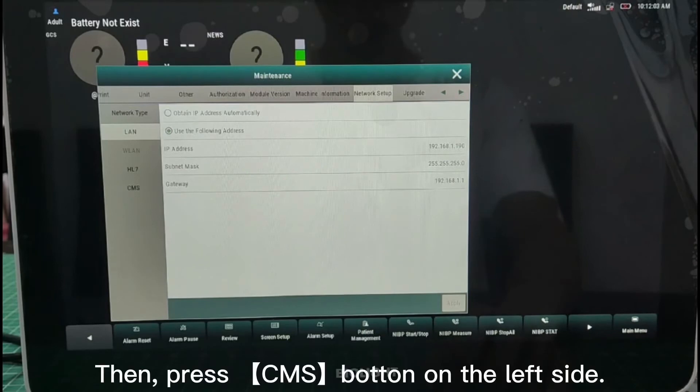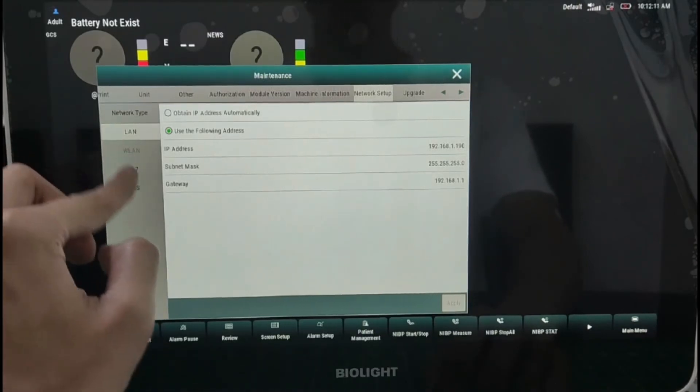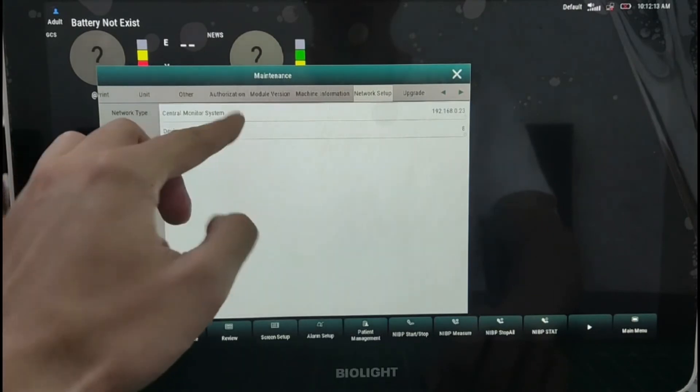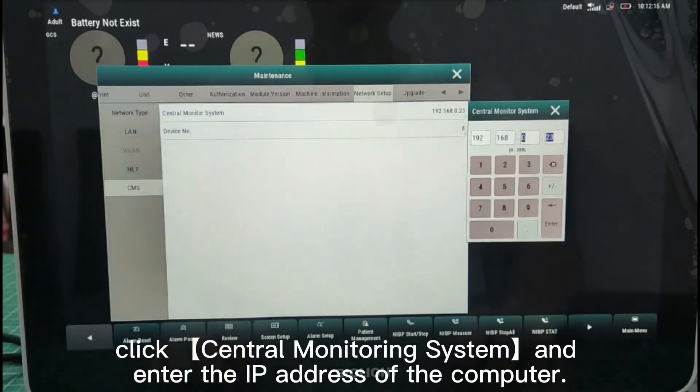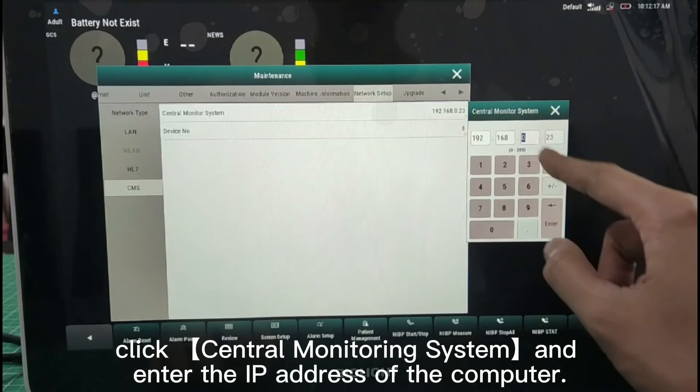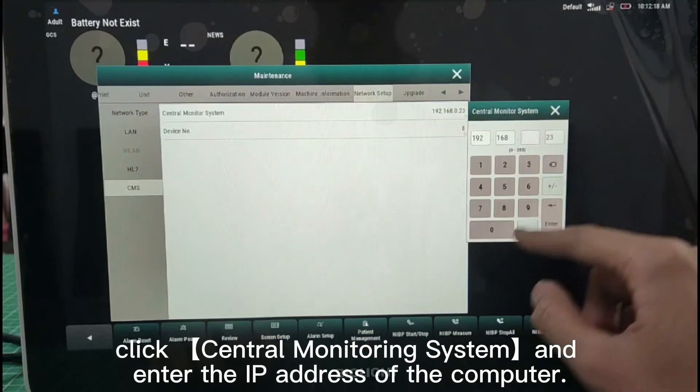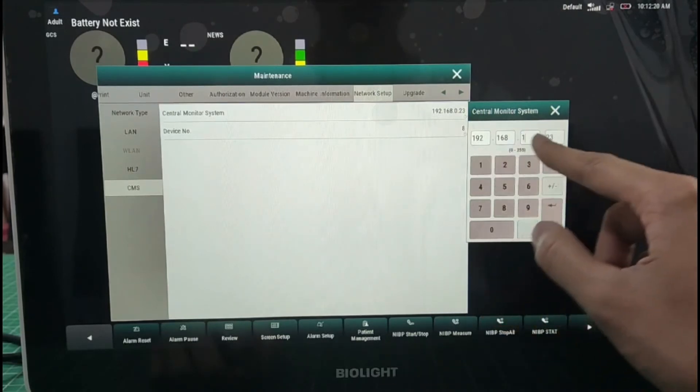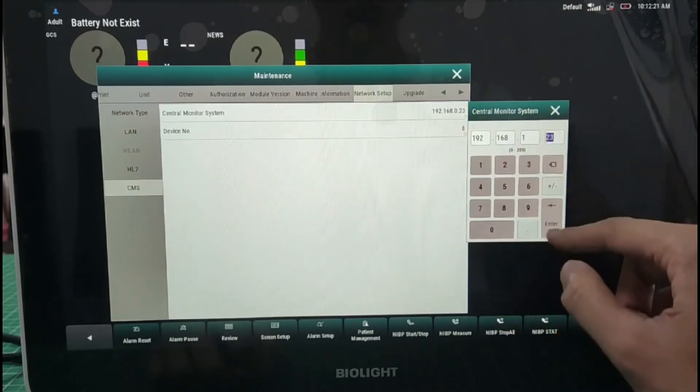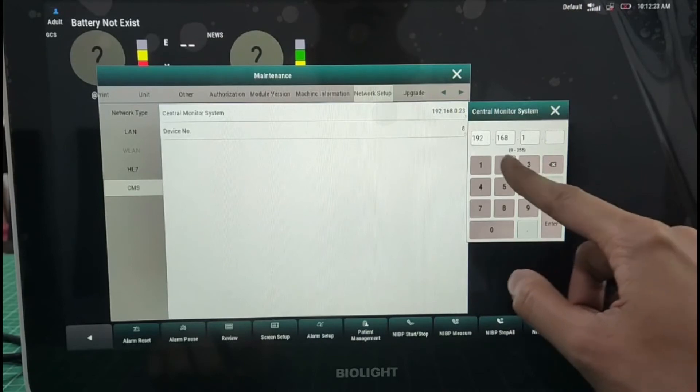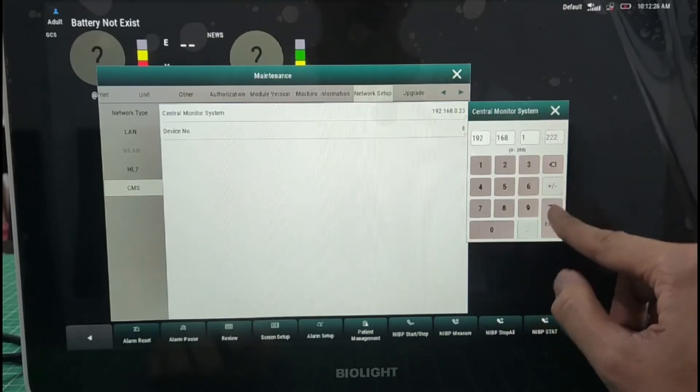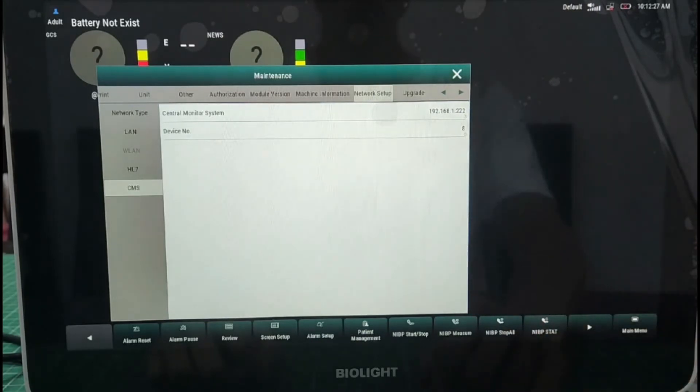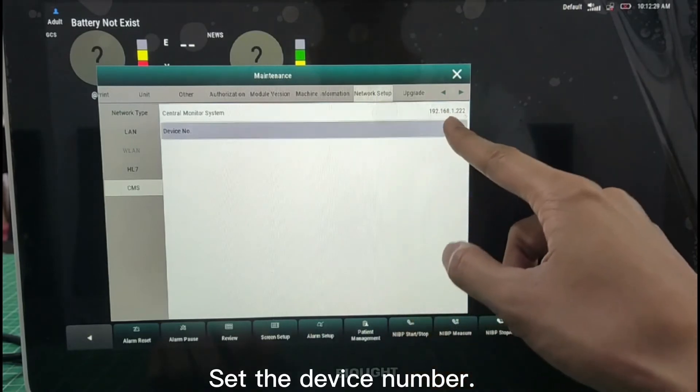Then press CMS button on the left side. Click Central Monitoring System and enter the IP address of the computer. Set the device number.